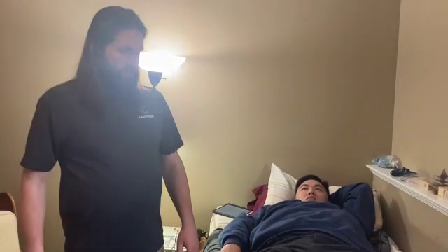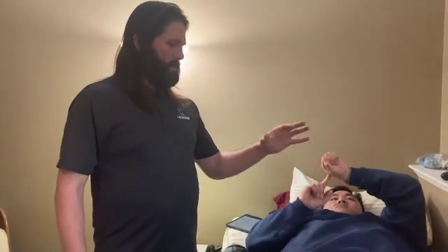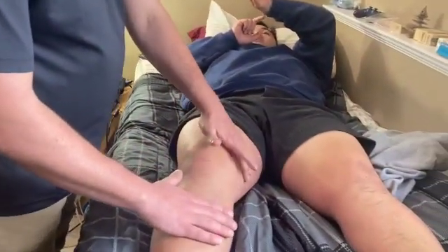So some contraindications for electrical stimulation would include, like, if you had a pacemaker, we wouldn't be doing this up near his shoulders, up on his upper body, anywhere. If you have a pregnant patient, you wouldn't want to do it anywhere around there. But the most relevant contraindications for this case would be if you had any sensory deficits or skin lesions around his knee. So we'll just do a quick inspection of the skin around the area that we want to treat.